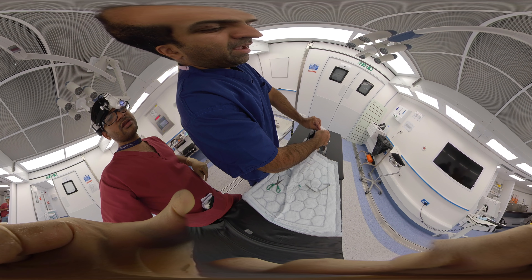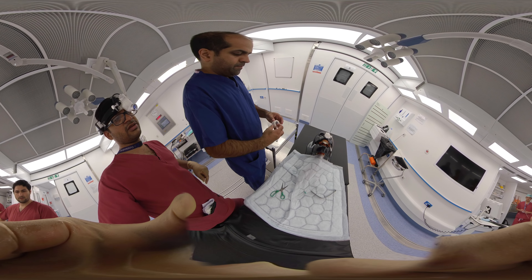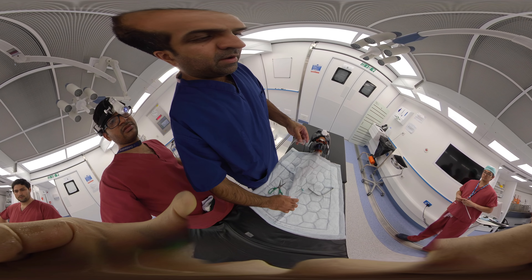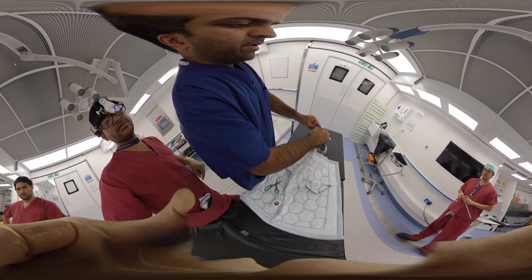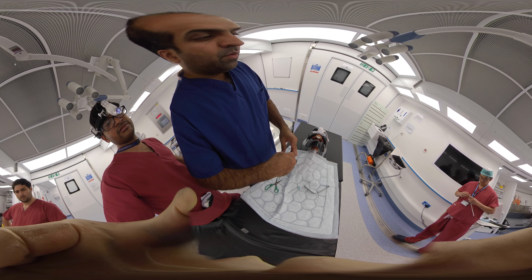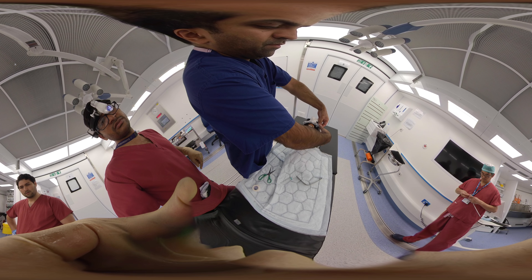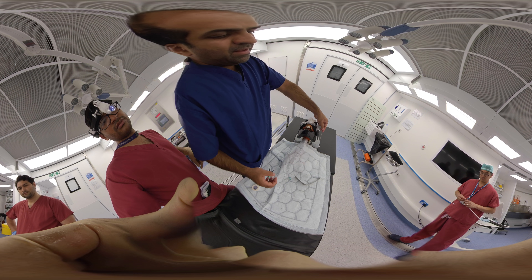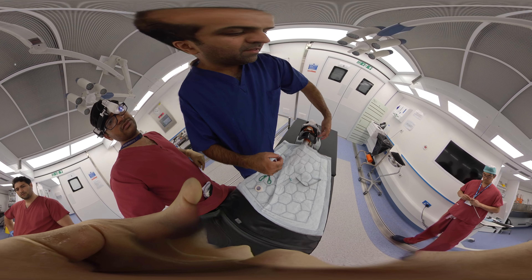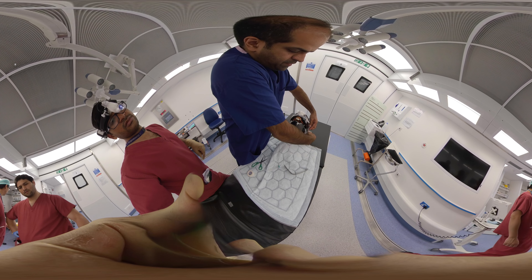Once that is prepared, take a piece of tape and simply secure the gauze — either on the nose or on the upper lip. Then secure your rapid rhino in place. I prefer to route it behind the ear, as it is much more comfortable for patients — take it behind the ear and tape it out of the way.